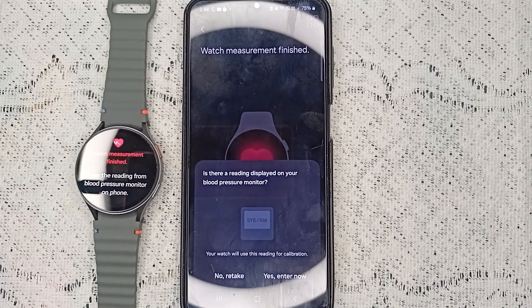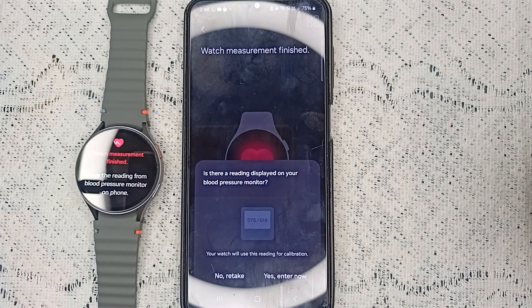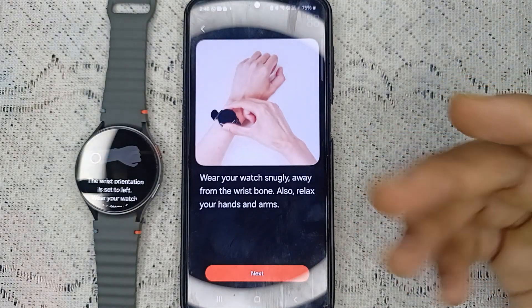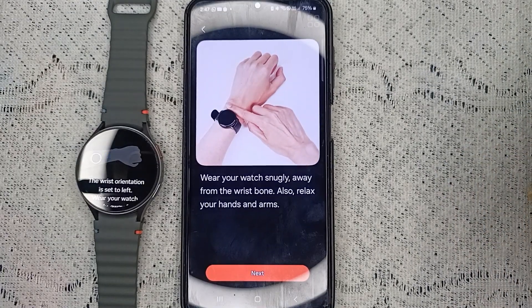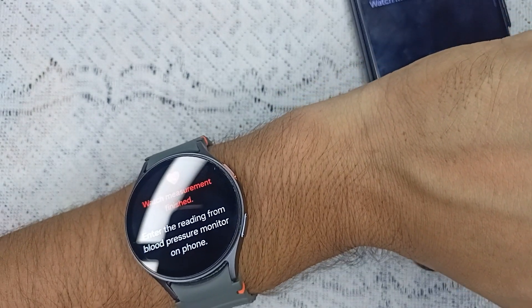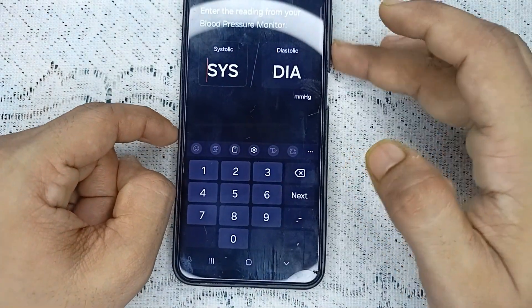Once the measurement is completed, it will ask you to display your blood pressure monitor reading. Note: the system timed out here, so we will redo the process. After completing the measurement again, it will ask for the reading from the blood pressure monitor on your phone. Tap 'Enter Now' to proceed.